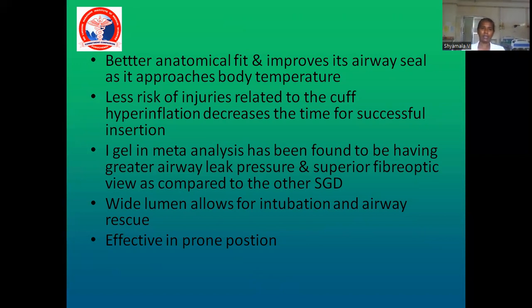It has less risk of injury related to cuff hyperinflation and decreased time of successful insertion, because here the tip doesn't roll over the epiglottis.